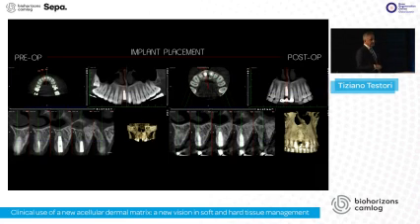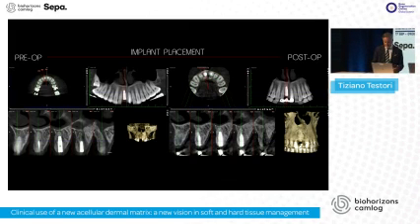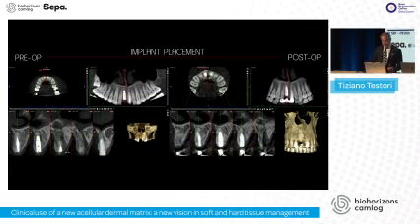This is pre-op, this is immediately post-op with the bone graft that we placed.